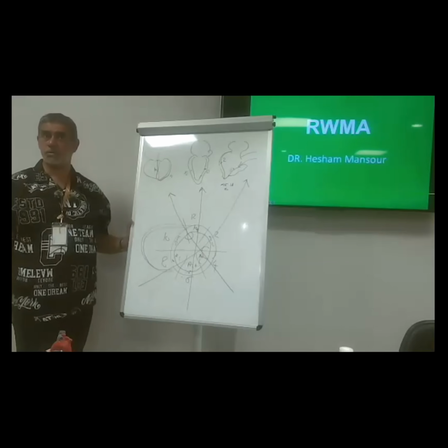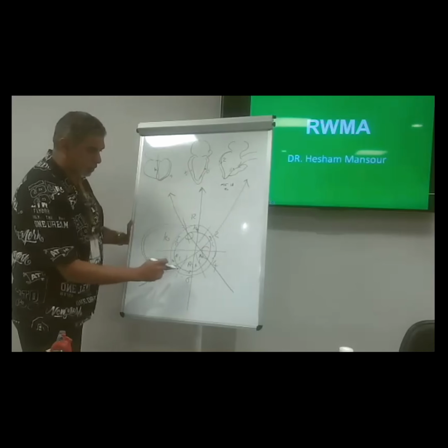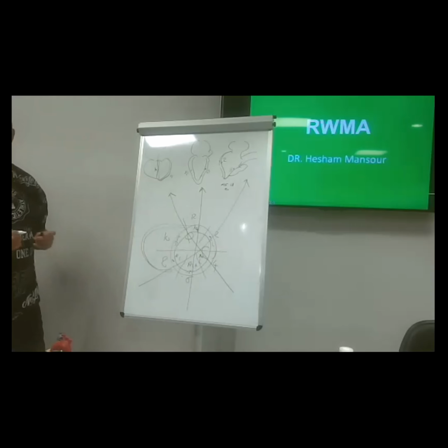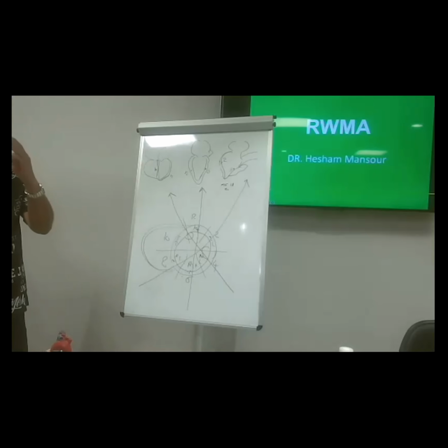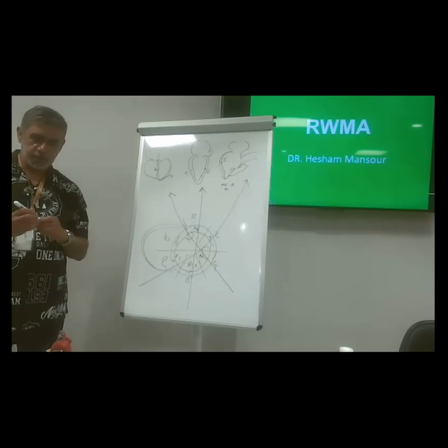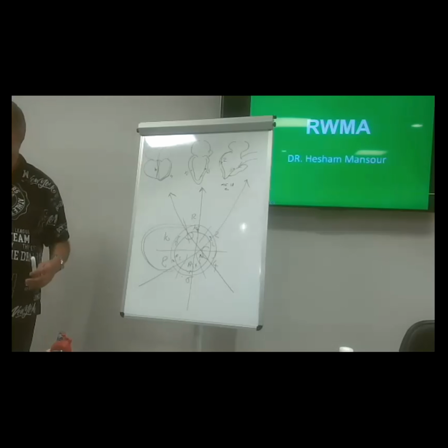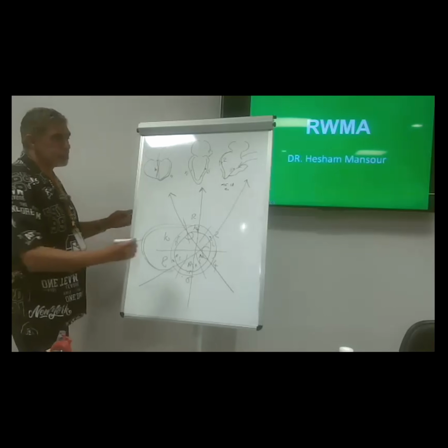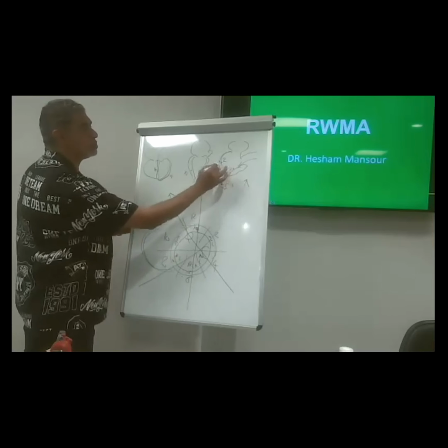You notice something? I didn't mention this one. I mentioned 1, 2, 3, 4, right? Why? I mentioned 2, 12, 6, 8. 2 plus 12 equals 14. 6 plus 8 equals 14. 2, 12, 6, 8. This is the equation I want you to come out of this room with in your mind. This is your target in the OR.